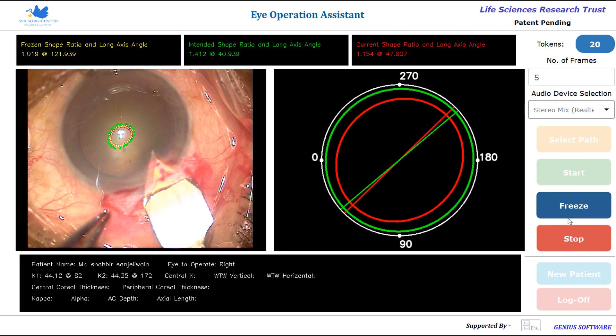At this moment, the current shape and the intended shape, as you can see, are perfectly overlapping with each other. At this moment of corneal deformation, if the incision is taken, it will produce a perfectly spheric cornea in this case.